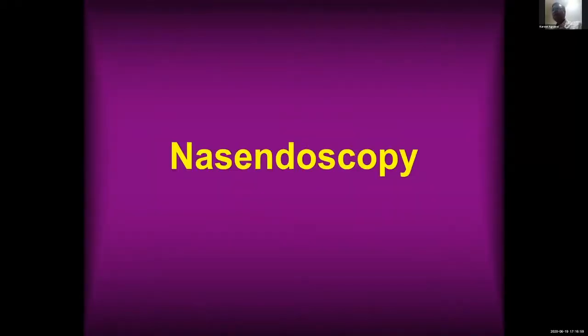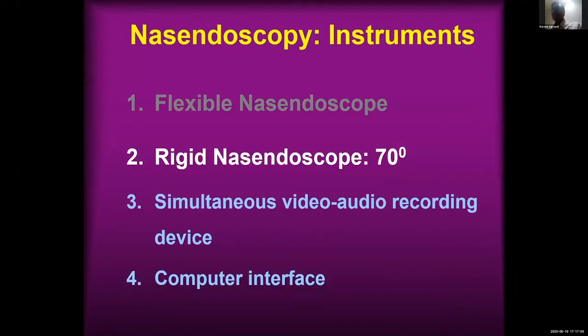Now, coming to the nasendoscopy, Dr. Mukund has already covered extensively the role of endoscope and how it has to be assessed. What I am trying to present here is the rigid nasendoscope, because most of the people who are using nasendoscopy use the flexible, which is the most popular nasendoscope at present. But I tend to use rigid endoscope wherever it is possible.